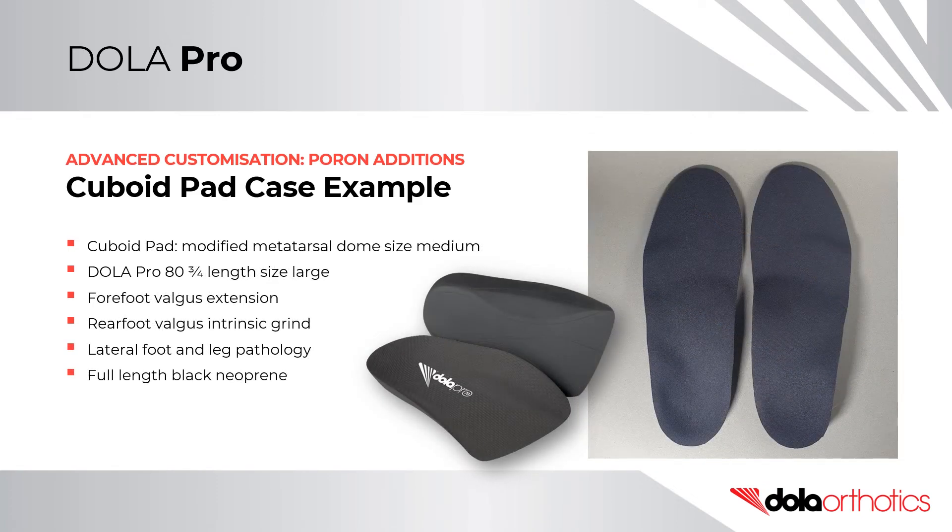In this case example, a size medium Poron metatarsal dome was modified for a cuboid pad and was placed on a size large DollarPro 80 medium density three-quarter length orthotic shell. The three-quarter length was selected due to the restricted toe box depth of the patient's business footwear. The prescription required a sulcus length forefoot valgus extension, and a full length 1.5mm neoprene black top cover kept the forefoot thin while being protected with a plantar Durafit forefoot extension.